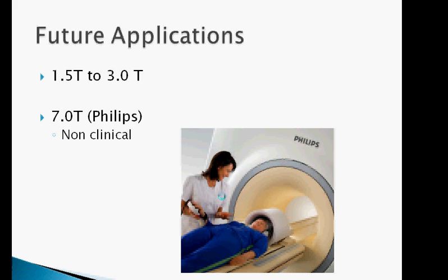And some of the future applications for this: Philips has developed a 7 Tesla unit MRI. This unit is used only for studies now, not for clinical purposes. Philips claims that this system produces much more exquisite detail images, enabling you to gain a deeper insight into the psychological and cognitive process of the brain. As well, its strength makes it quicker and gives better results.